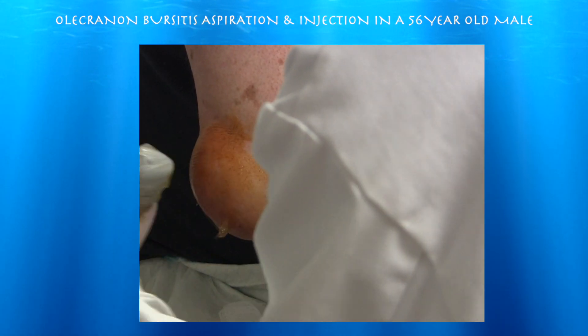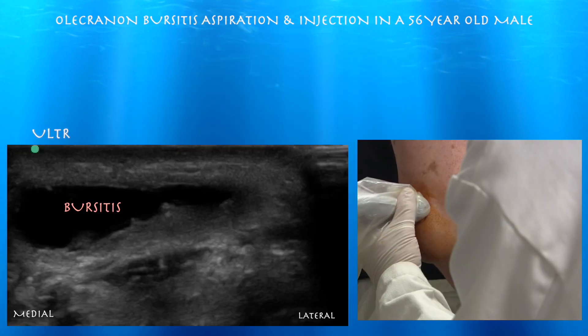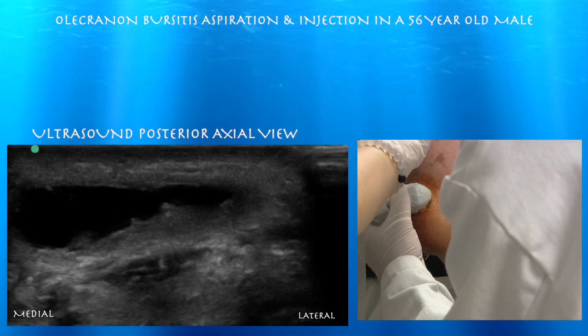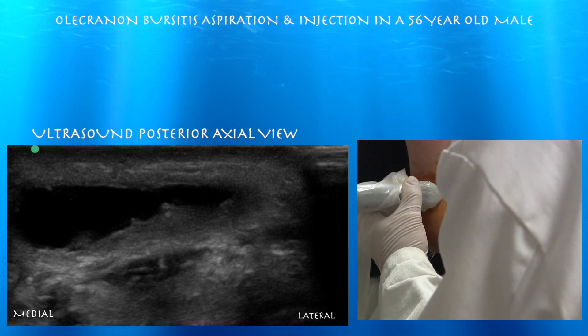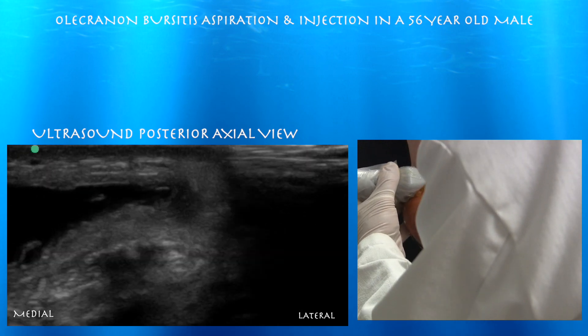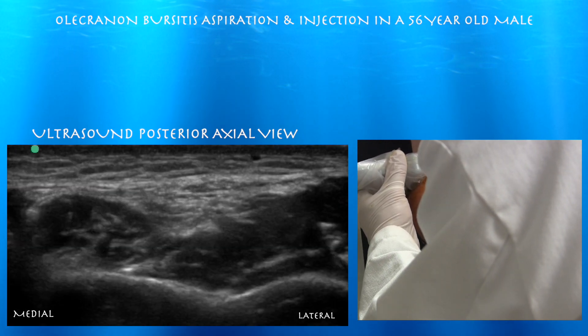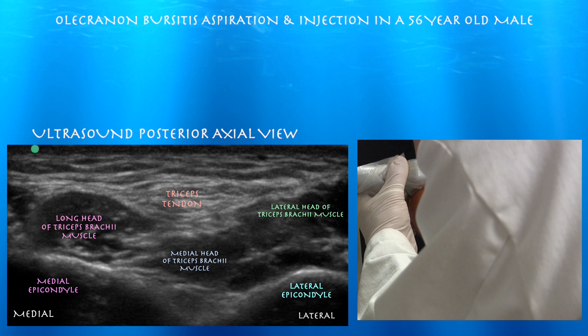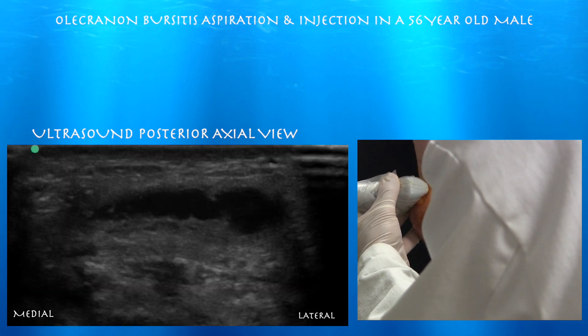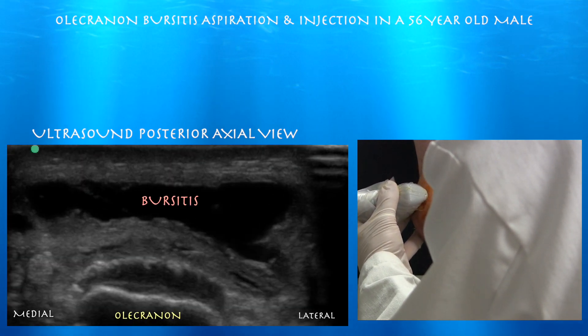We're going to go on an axial view now. Now we're in axial view. Right side of the screen is radial, left is ulnar. You can see his triceps tendon here — the long head and the lateral head surrounding the triceps tendon on either side. And you can see the medial head of the triceps deep to that. Here's this pretty large bursitis as we come towards the olecranon.